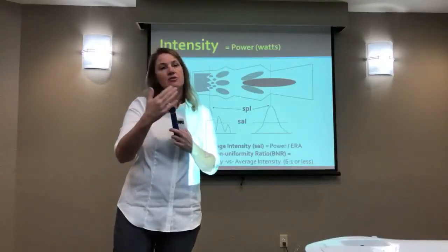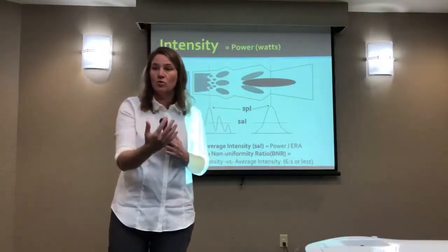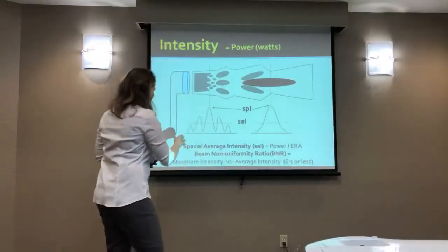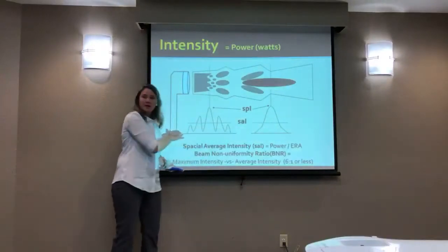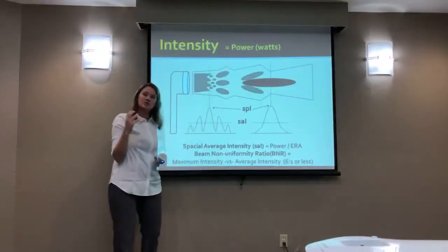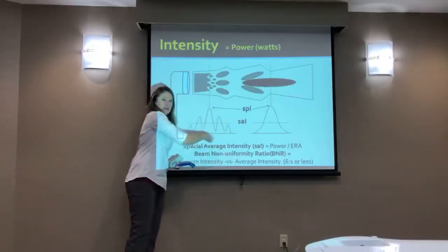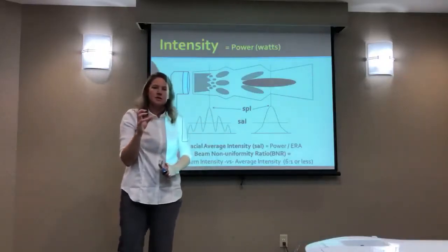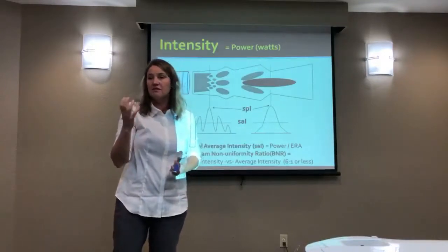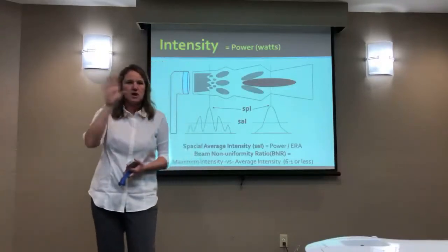What happens is that energy, as it's penetrating, as it reflects, refracts, and absorbs, is going to do that non-uniformly. And the field of energy is going to become quickly non-uniform. So if I was to take a cross section and look at the energy being distributed in your tissue, for example, it's going to be non-uniform. You're going to have uneven amounts of kinetic energy being delivered. We can think of that in the form of heat, in the form of treatment outcomes being non-uniform.